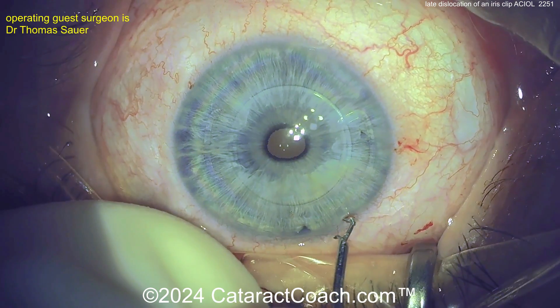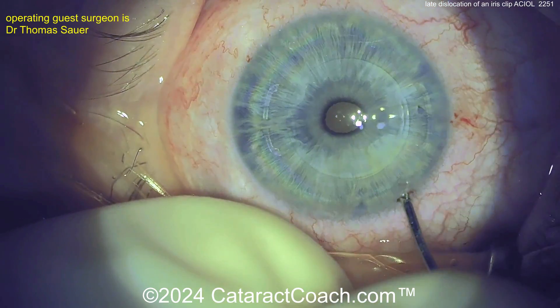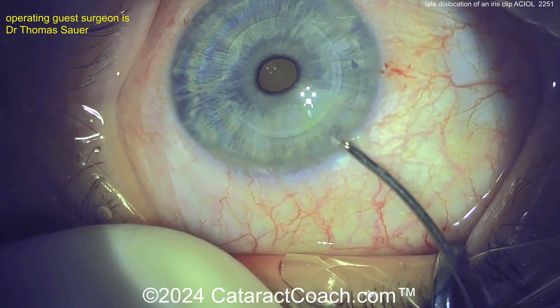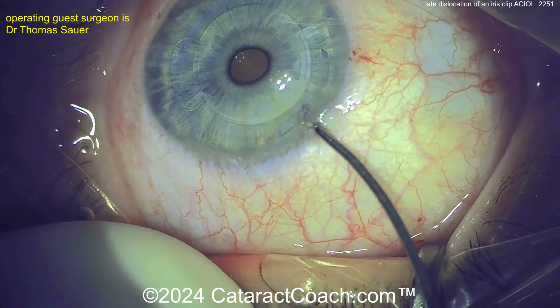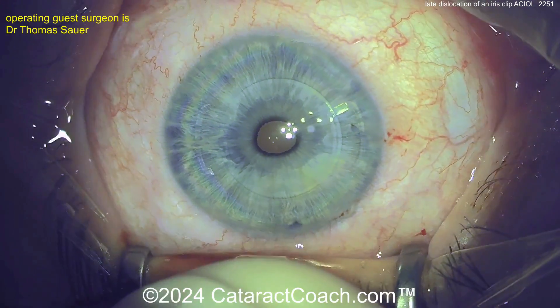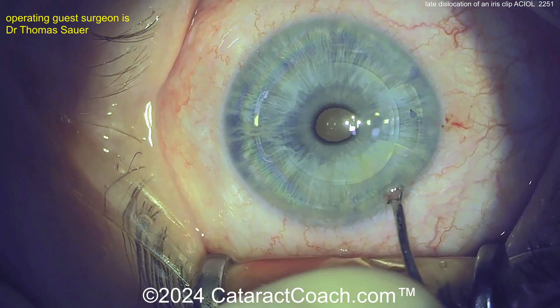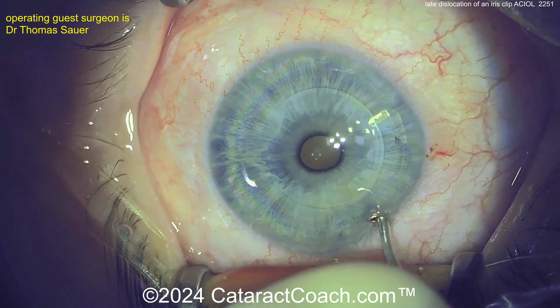This is a neat instrument. The surgeon said he found it in a box of instruments that his mentor gave him — it's called a spreader. This is where your staff comes in: your circulating nurse and scrub tech. The scrub tech who trained with your mentor said, 'The other surgeon had a special instrument called a spreader — I bet that would work here.' The device has two little hooks that, when placed inside, open up the claw of the right-sided haptic.